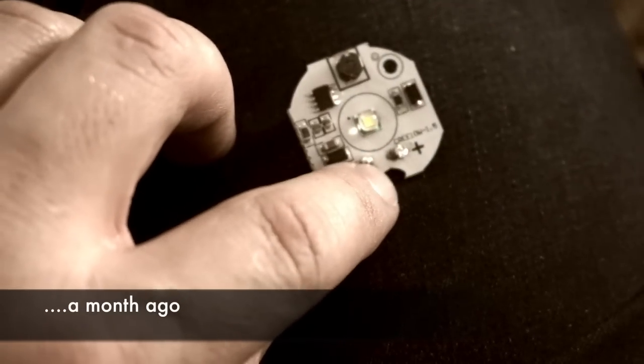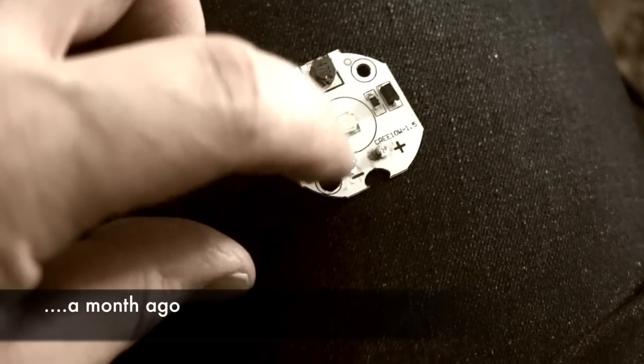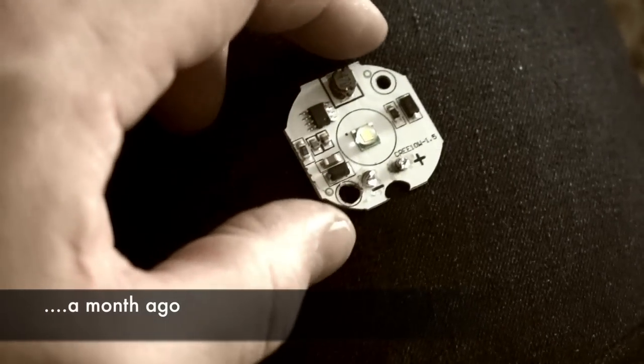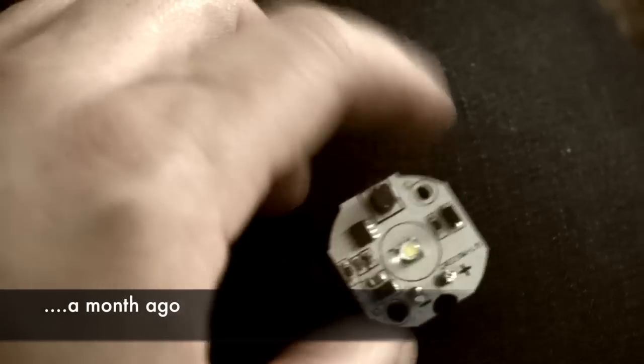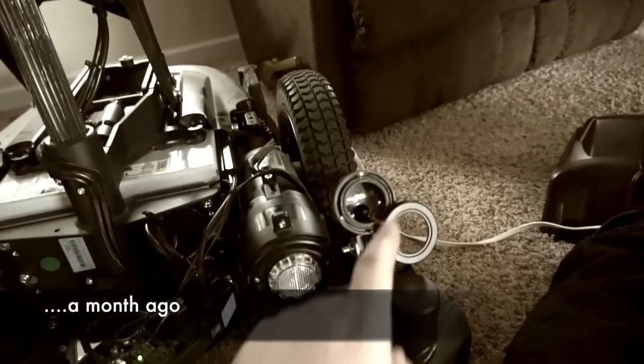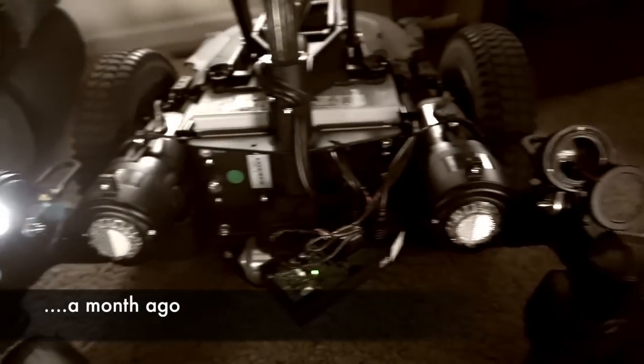You can see right here on this positive cable — see that little black mark? That has shorted the trace out between the two halves. He's going to see about getting Amazon to send a replacement. In the meanwhile, we've kept that side disconnected. I'm going to put it back together and we'll have one light — that's better than nothing. I think I've got everything I need and we're going to head over there.